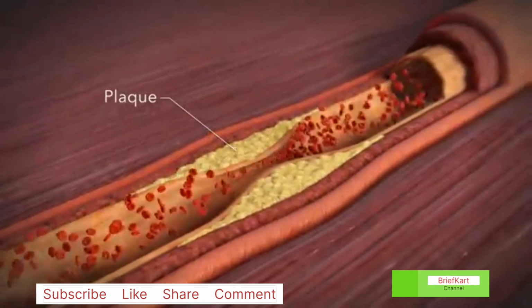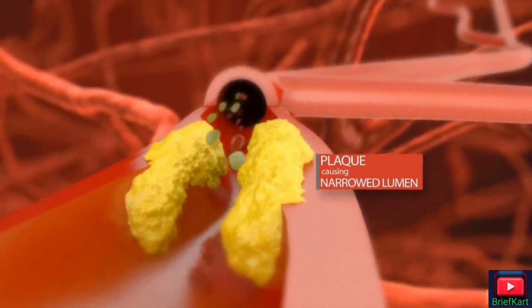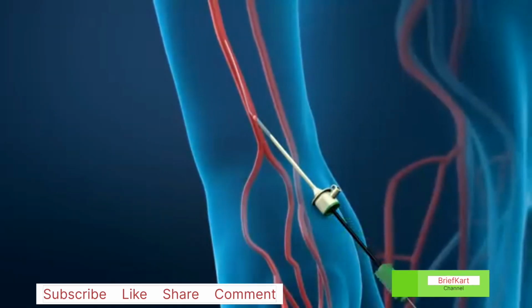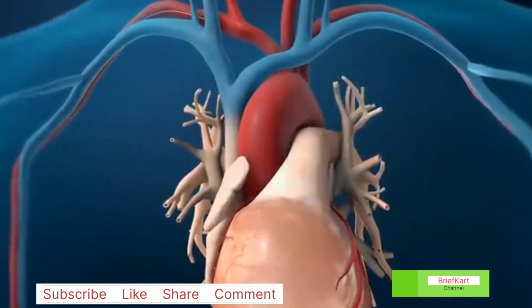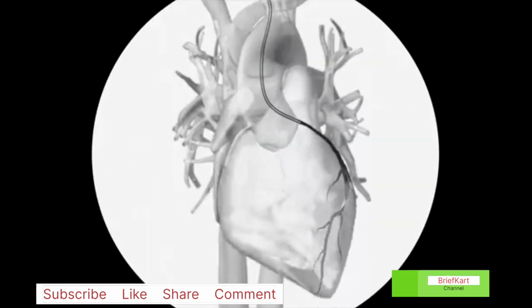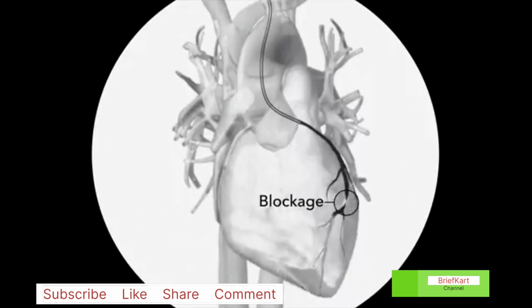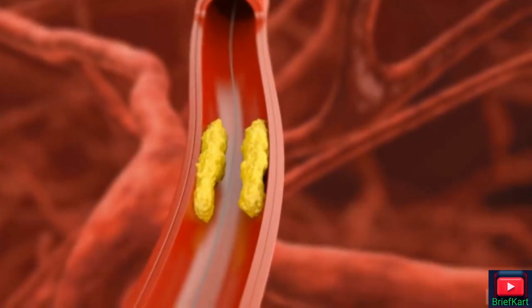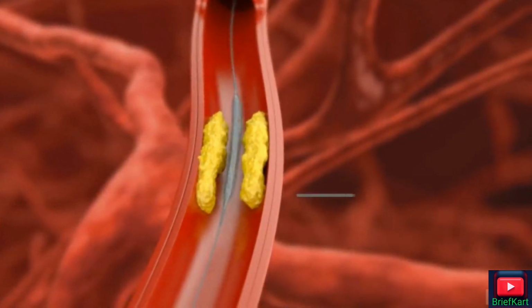Over time, the walls of your arteries can become filled up with fatty deposits. A diagnostic procedure known as coronary angiography is used to image these arteries, by injecting contrast into them and projecting this on a series of X-rays to outline the inner vessel wall and show flow through the lumen. An angioplasty procedure, a therapeutic step, is used to help relieve symptoms of CAD.